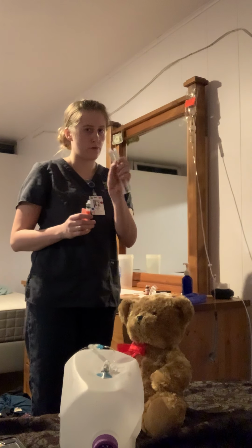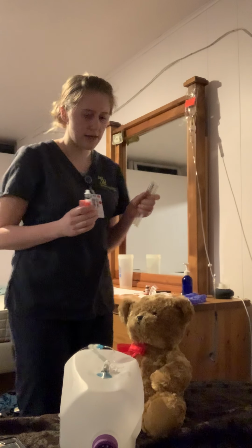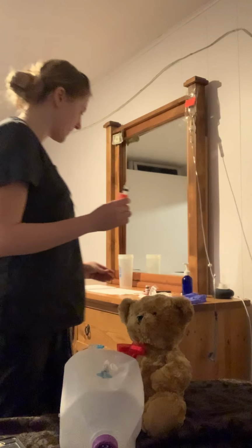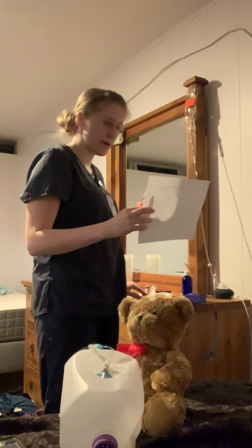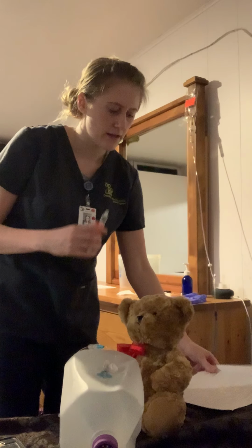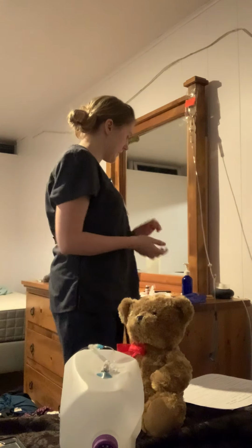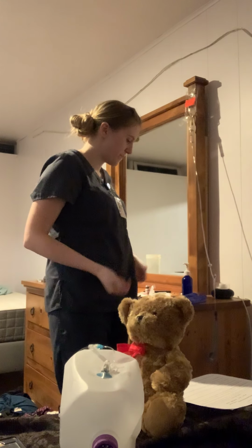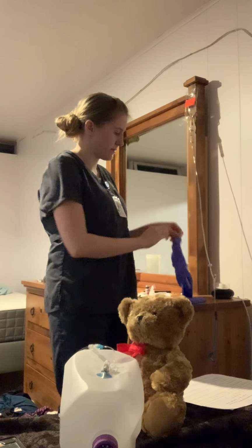I've got my two normal saline solution to prime the line. So I'll just put that beside the patient. I've got my MAR here that I'm going to bring into the room to compare. I've got my furosemide. And then I'm going to do some hand hygiene before I go into the room. And then I'd also put on some gloves.